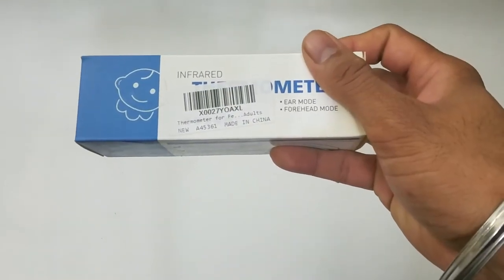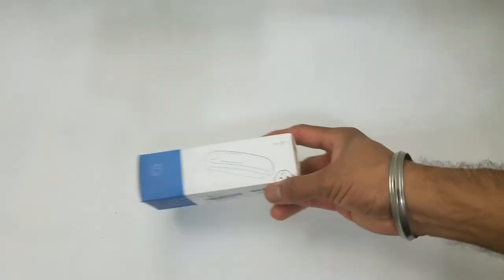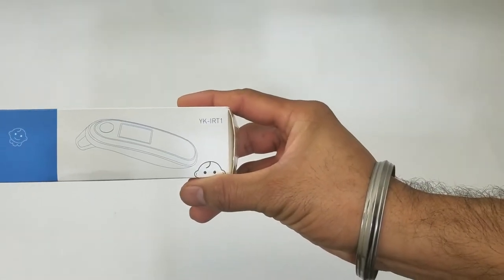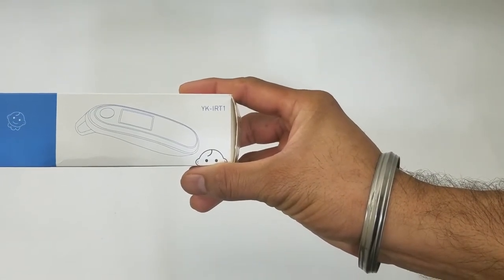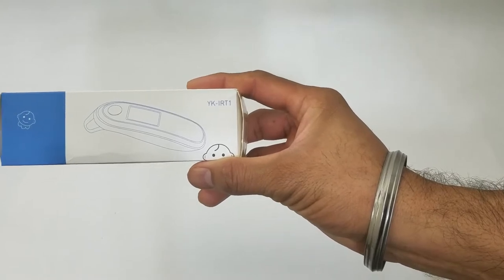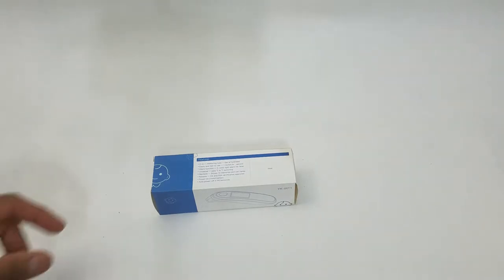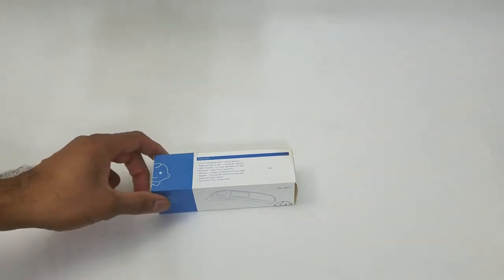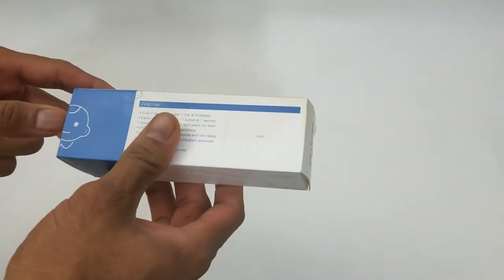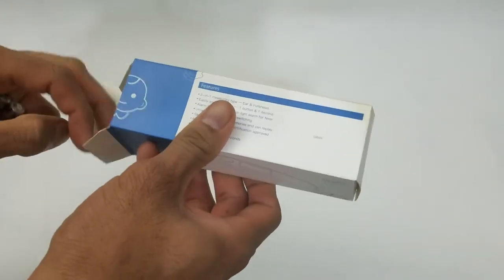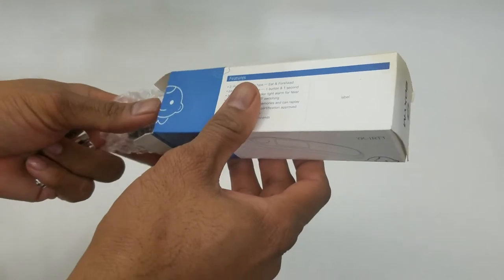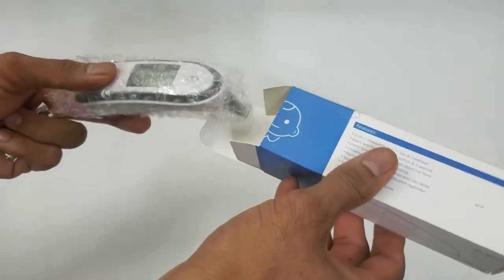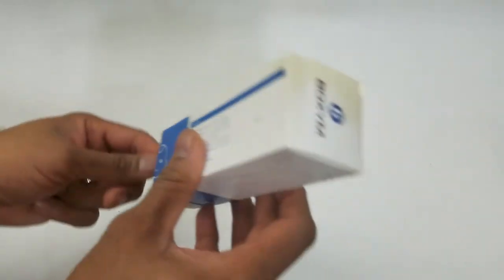This is the product UPC code and the model number is YK-IRT1. Because it's an infrared thermometer, it can pick up body temperature really quick without too much discomfort. Especially when you have young kids, toddlers, or even if you're an adult that doesn't like other methods. This can come in handy.